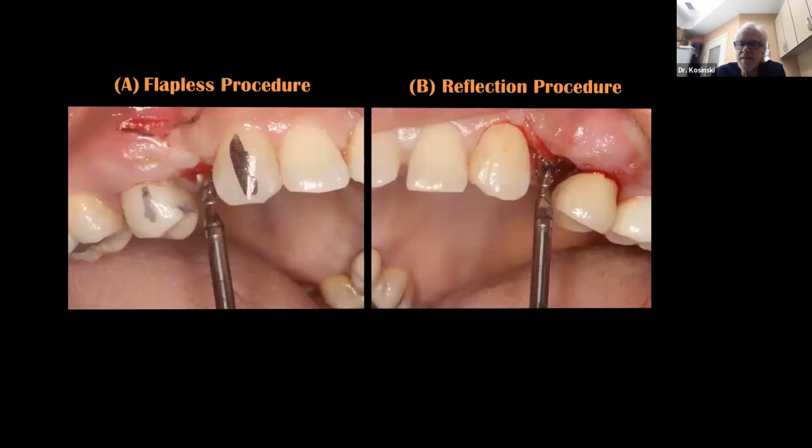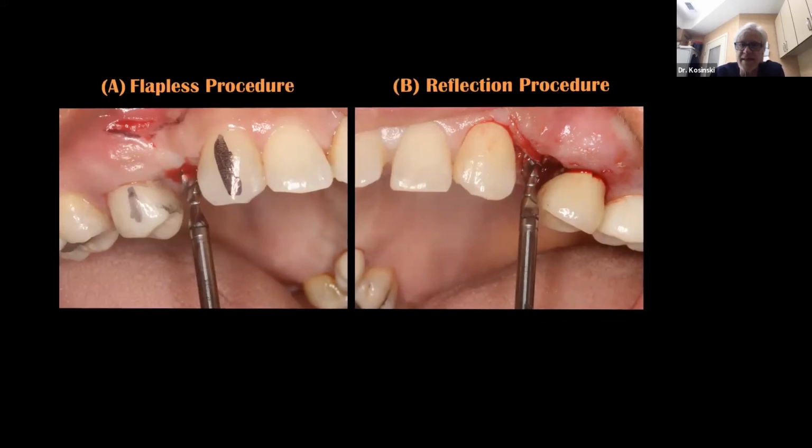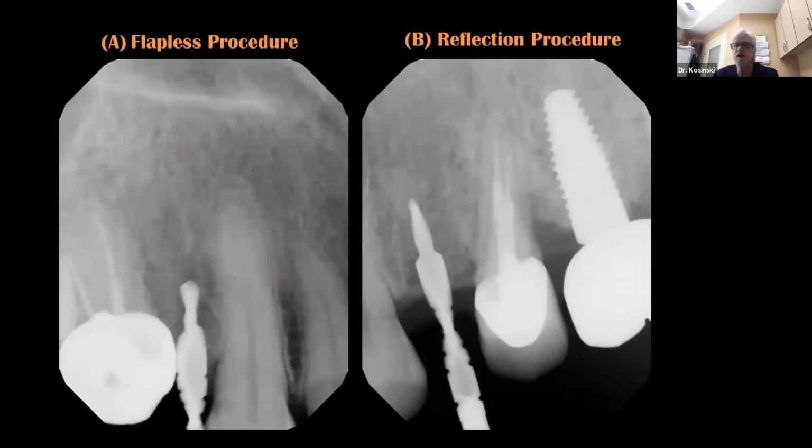So I'm simply taking this 2.4 diameter pilot burr, drilling a small amount so I can see my angulation, and simply take a radiograph. And what am I looking at, doctors? I'm looking at my mesial distal angulation on the radiograph. My dark spaces on either side, are they correct? Am I happy with the angulation of the subsequent implant? I'm thinking tooth up in this situation.